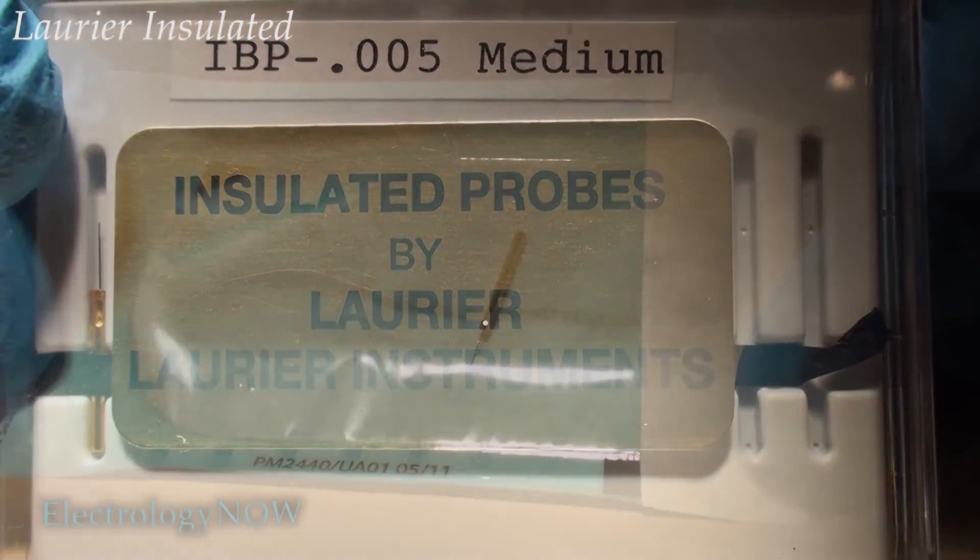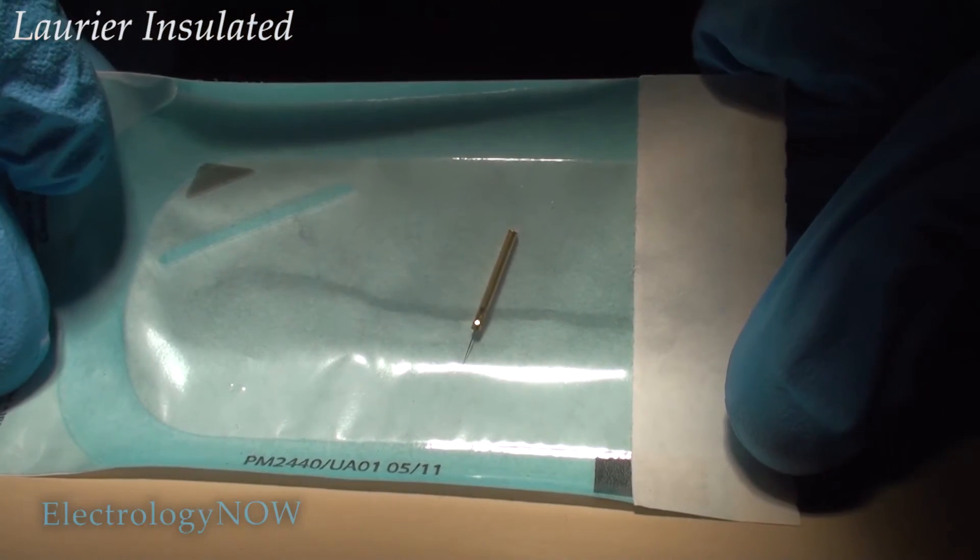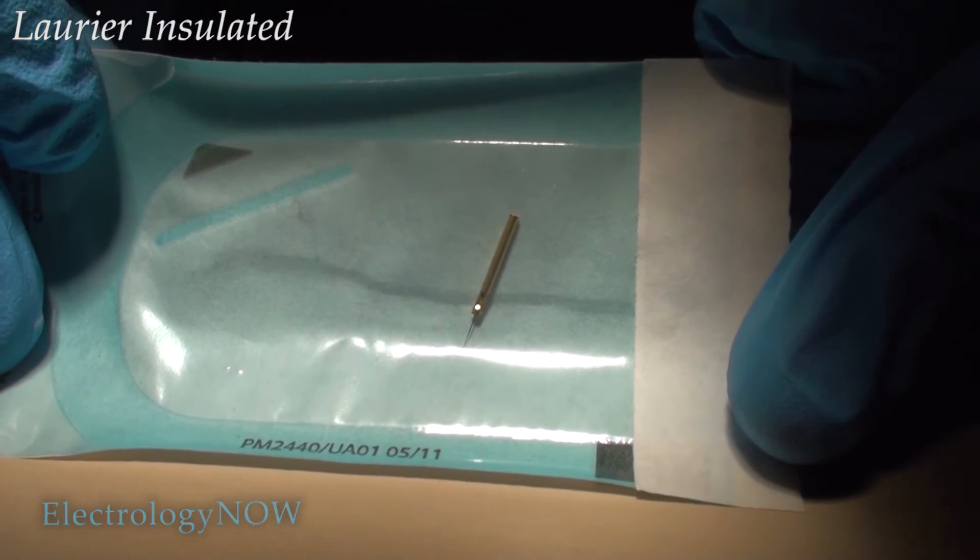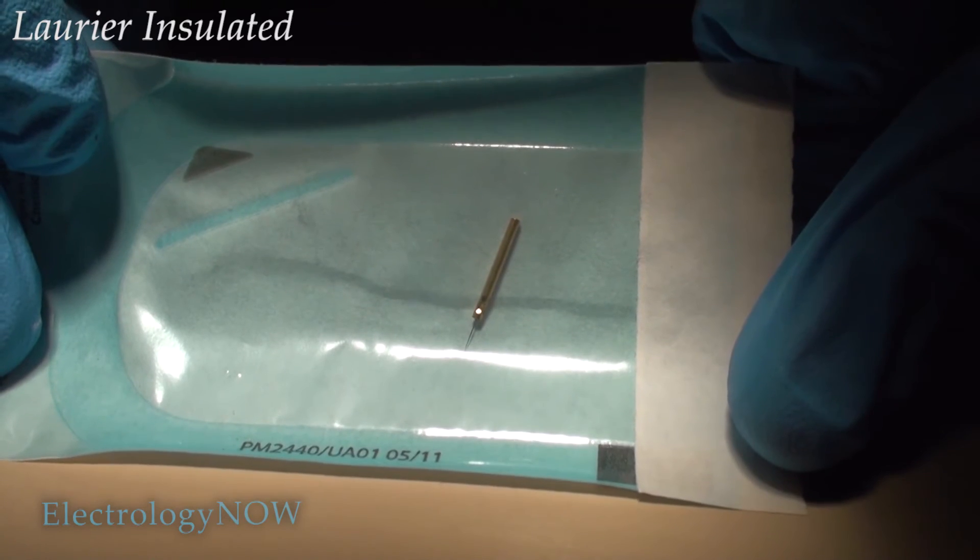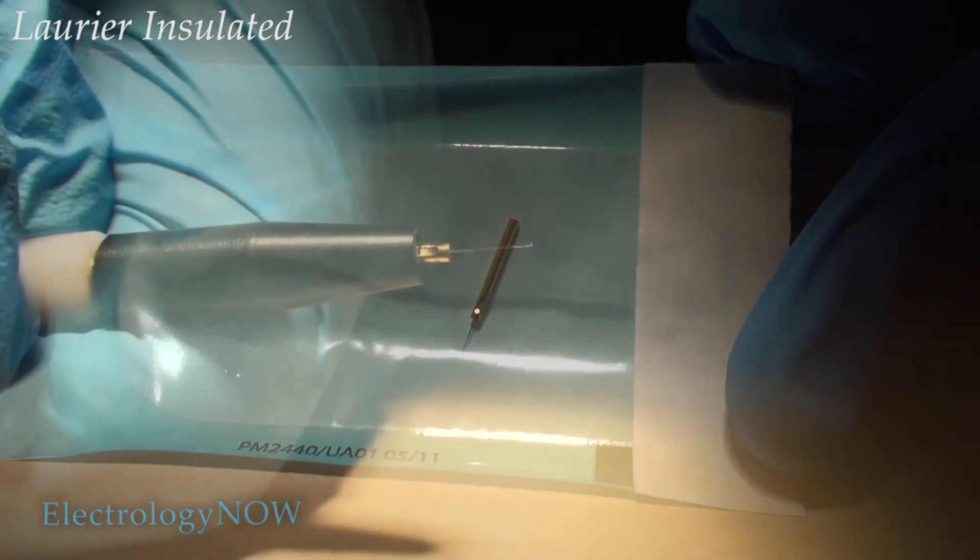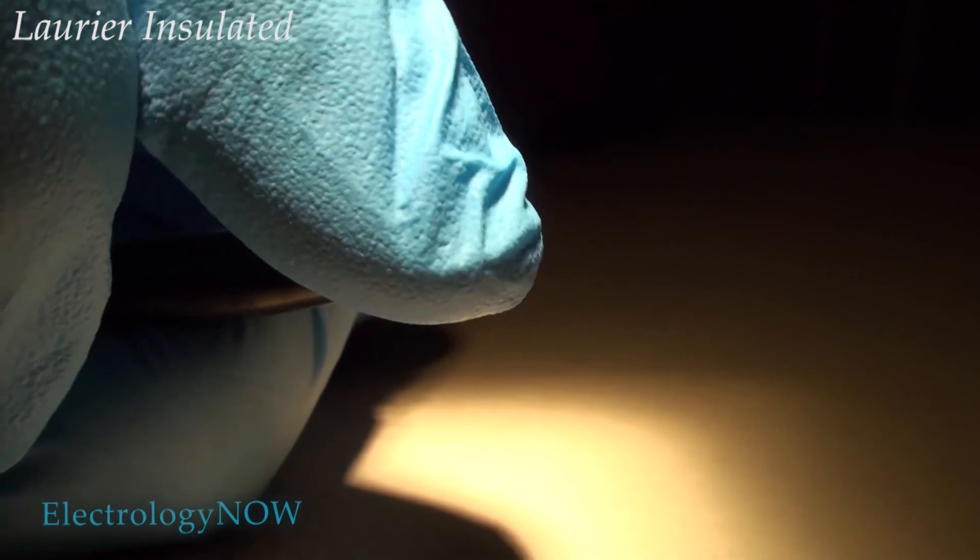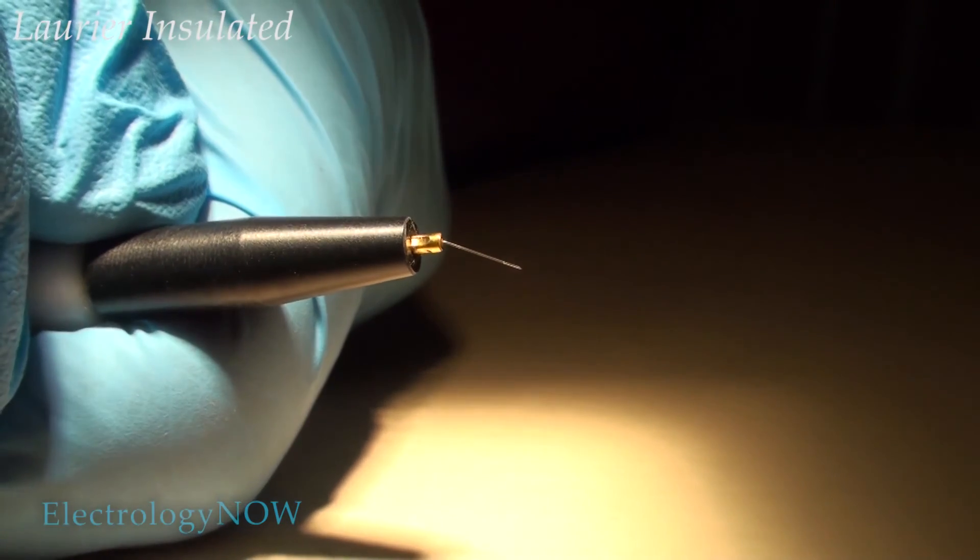The Laurier insulated needles also come pre-sterilized and they come in a little blister pack like the one I'm showing. The Laurier needle is very easy to bend. Just a little bit of pushing with your finger will do the trick.